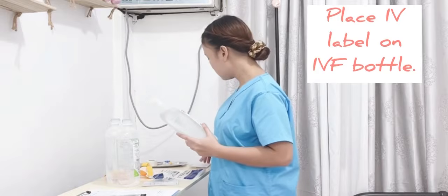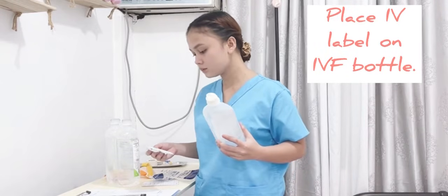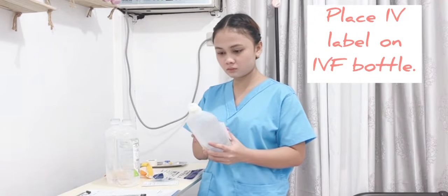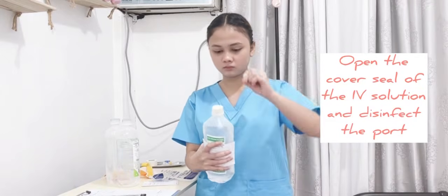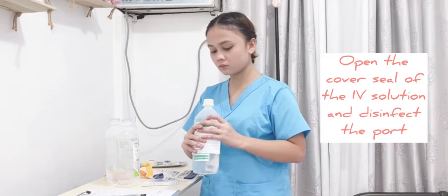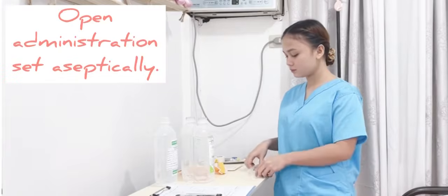Then place IV label on IVF bottle, which includes patient's name, solution type, additives, date, and time. Then open the cover seal of the IV solution and disinfect the port. Make sure that you do not touch the port of entry. It prevents bacteria from entering infusion equipment and the bloodstream.